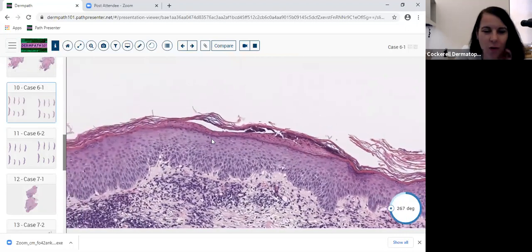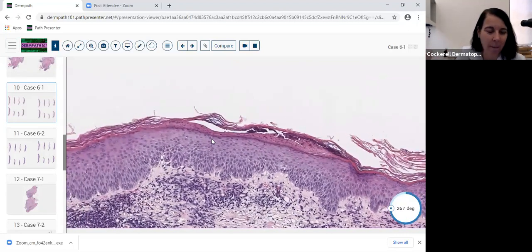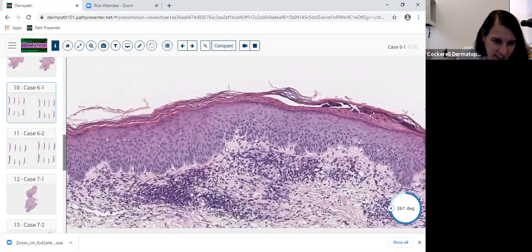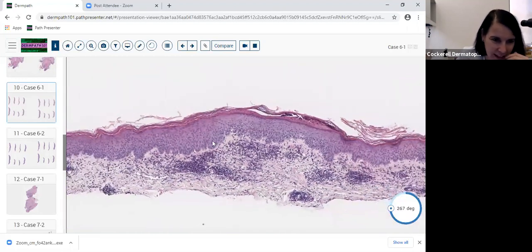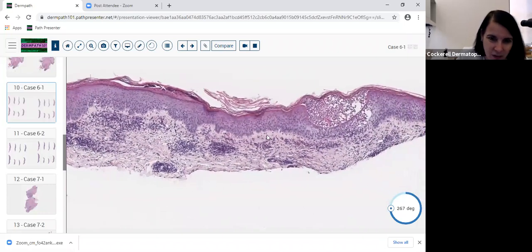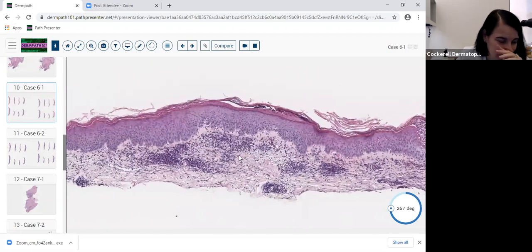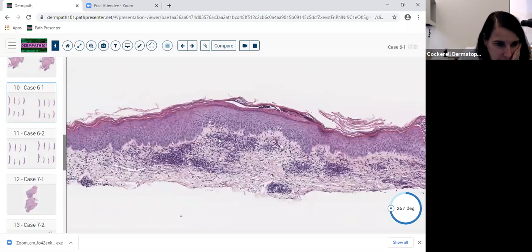Is this getting to be the so-called Ackerman sandwich sign where you see compact keratin juxtaposed to the basket weave orthokeratosis? Sandwich sign you can see in a lot of entities. You can see it in PLEVA, you can see it in PRP, you can see it in guttate psoriasis. So you can't use the sandwich sign completely, but this is suspicious enough that when I see neutrophils here, I better rule out a fungal, a superficial fungal infection, a tinea, or even candidiasis. I better rule it out.